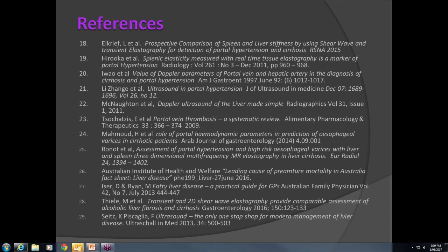And also, Amanda's asked, if someone presents with just a request from an ARFI, do you just follow the final flow chart you put up? Do you mean the chronic liver chart? Yes. At this point, if they're not specifically HCV, we haven't got the other data yet.